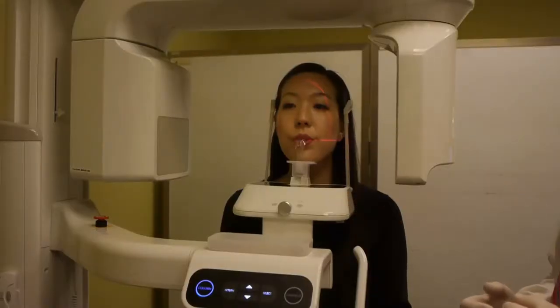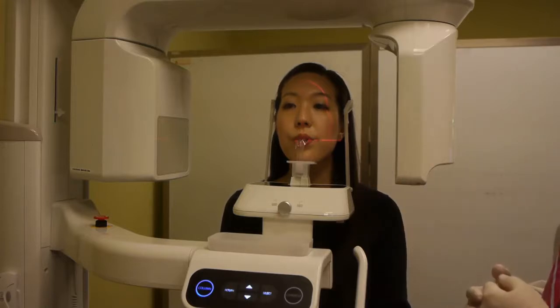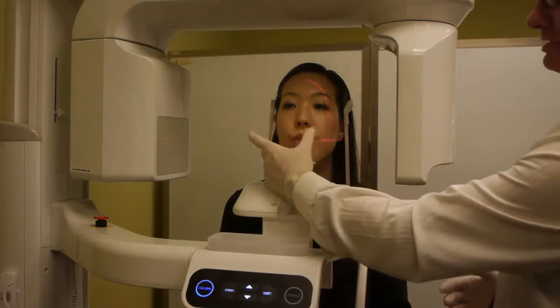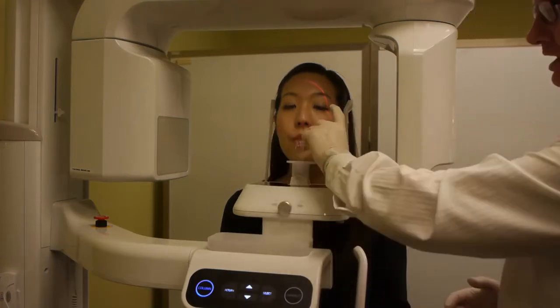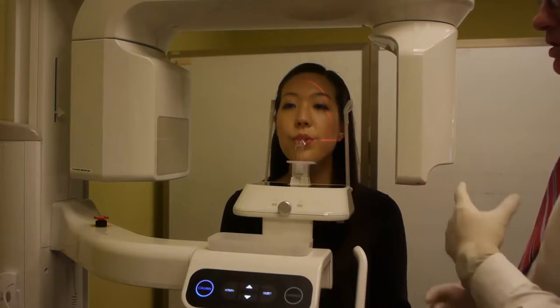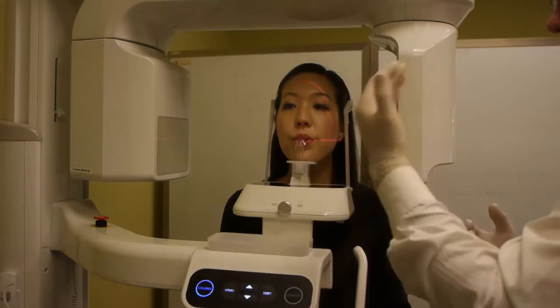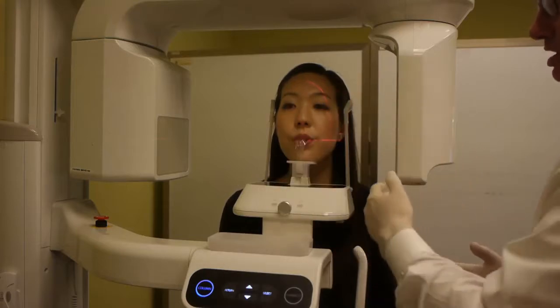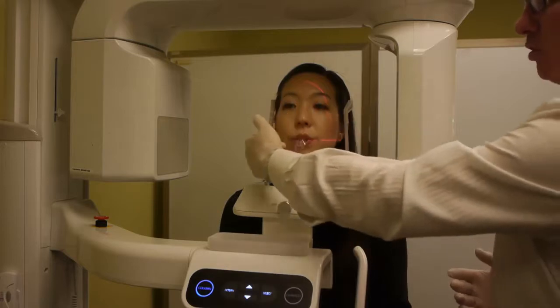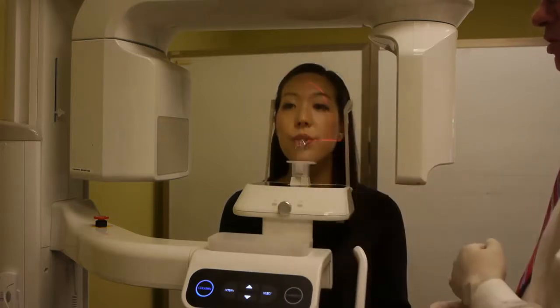In this next example, what we're going to do is a smaller field of view, what's called an 8x8, which means that the scan is 8 centimeters wide, 8 centimeters in depth, and 8 centimeters in height. In this case, this would be good for doing perhaps a dual arch from the anterior to the second molars, and what's also very common is where you want to capture the left or right hand side of what we call a dual arch, to do the upper arch and lower arch.